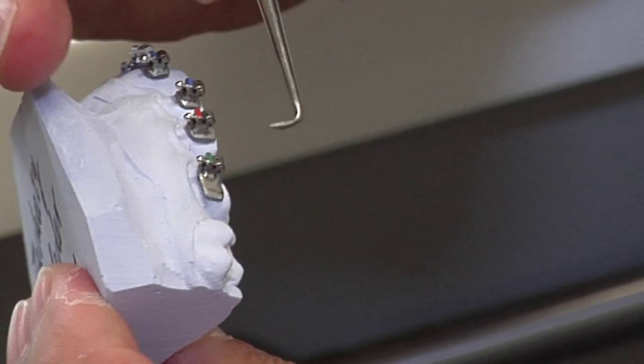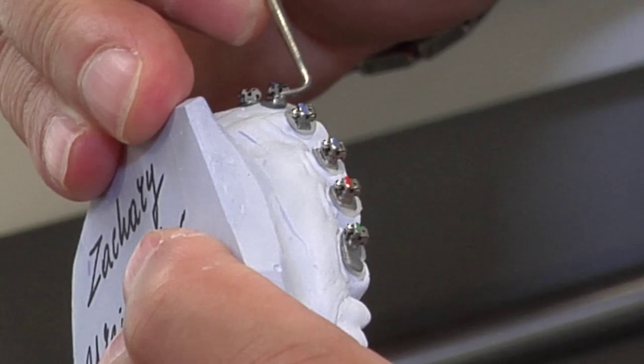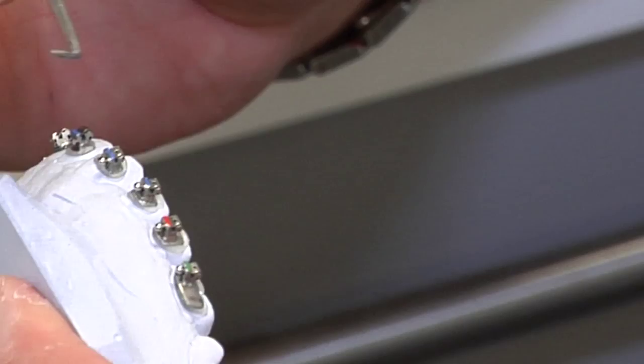This is a model, a Bluestone model. And the braces have been placed. And then I'm going to sequentially go and place each brace on each tooth in a very specific way. So again, the brace has a very specific spot on the tooth so that it moves the tooth efficiently and accurately. And so once I complete this, then I'll cure it and we'll go ahead and fabricate the transfer tray.